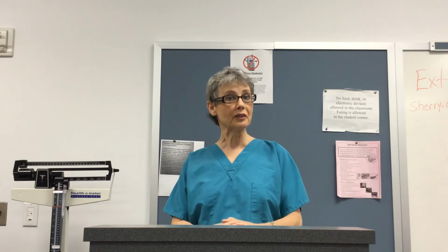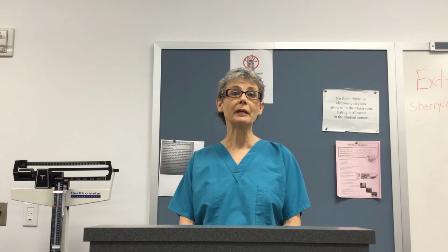But then the accountability nurse came in, the one that has professional accountability. She came on duty and she did what she was supposed to, and she unwrapped that IV and saw that it had infiltrated. And this medication caused her to have a 3rd-degree burn. And she's in her early 30s now, but she still has a very deformed foot because of that burn that she received. So let's be very careful. Let's be that nurse that has professional accountability and check the IVs as often as you can, at least every 2 hours.